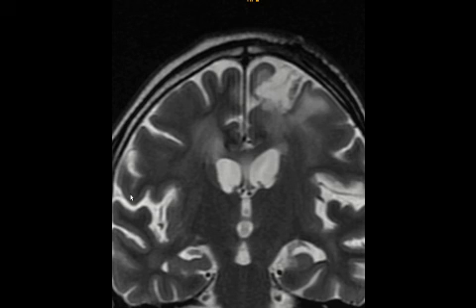This case was to demonstrate how important it is to get the previous scans. It is really of great significance to get the scan which was done before, because then it makes your life so much easier to compare and give a diagnosis. So keep that in mind, and thank you.